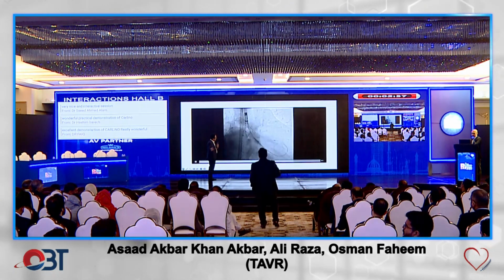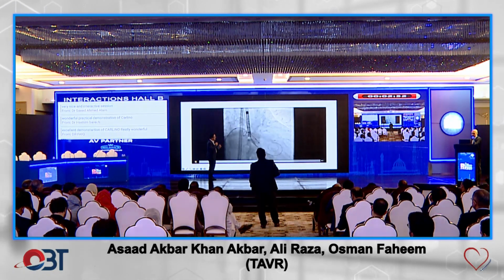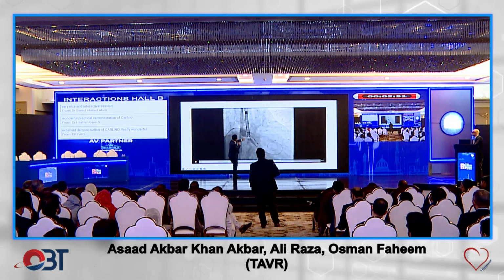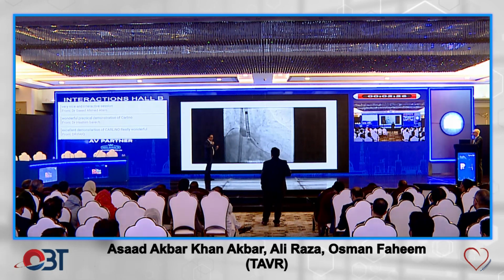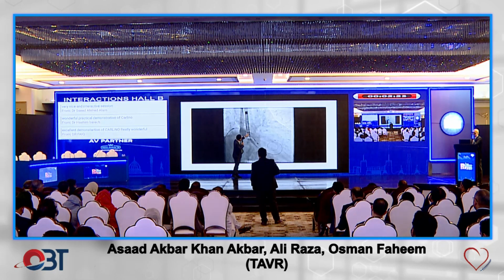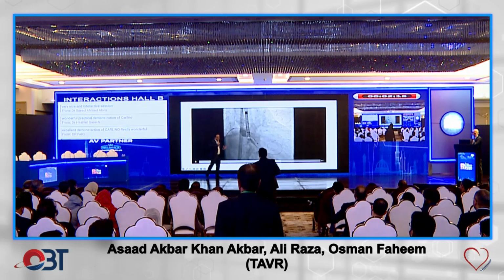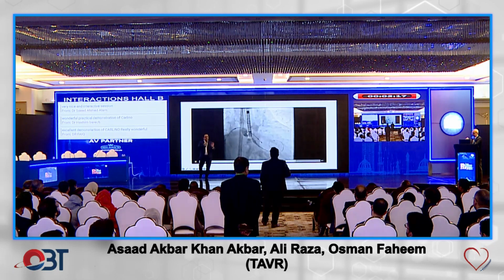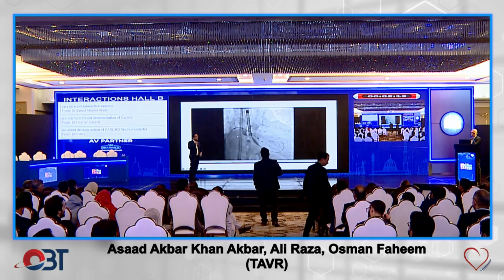So this commissural alignment thing that we were talking about, when you're talking about future TAVR in TAVR and so on, then you're looking at this hat marker. So for cusp overlap view, what you're looking for is that this hat marker, the thicker part, so this is the thin part, this is the C mark. This C part should be in front. If it's in the front, you have an 85% predictability that the commissure will not end up in front of your left coronary artery.